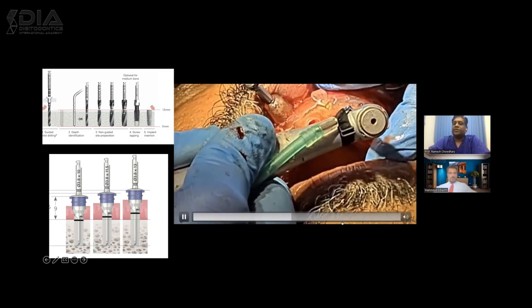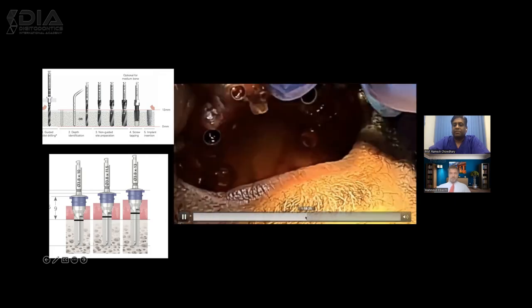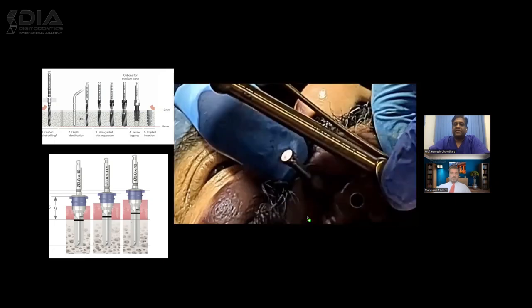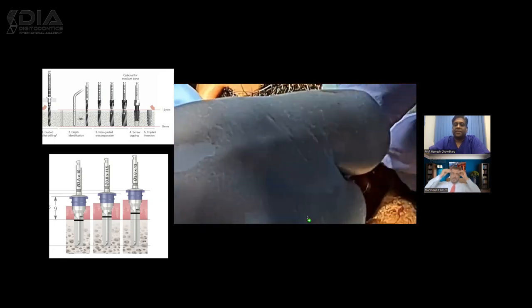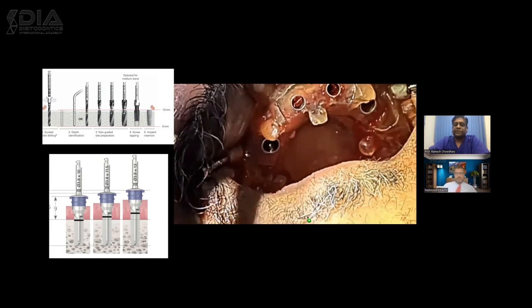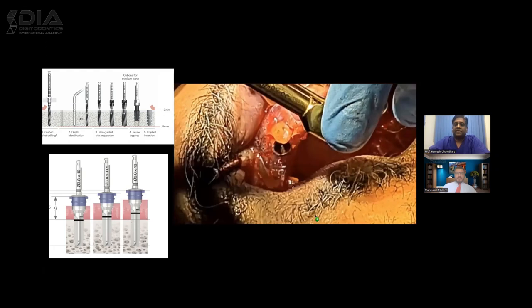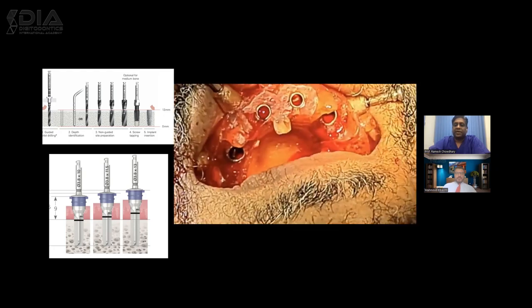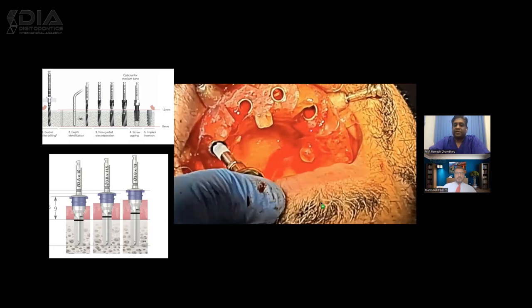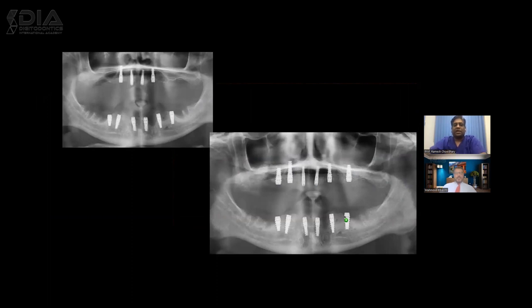I'm just skipping ahead in the video to show that, yeah, now the implants have been finally seated, and we are just giving a final torque to make them seat. This is one more implant placed, because I tried this manually, as I wanted to feel the stability of the implant. And this is how the implants are placed.